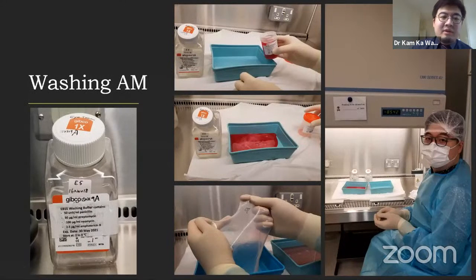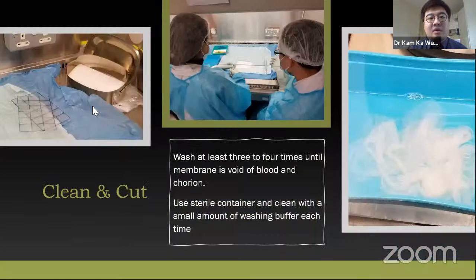We'll then transfer the amniotic membrane to our skin bank, and we'll work in a cabinet like this. We'll scrub up and wear sterile gloves. We'll pour the amniotic membrane into a sterile tray, and then wash it several times with this washing buffer, which contains penicillin, streptomycin, neomycin, and also amphotericin B as an antifungal. We'll then clean and cut the amniotic membrane according to the sizes that we designed. You can look at the grid here, and there's nitrocellulose paper here for us to mount the amniotic membrane. This is what the membrane looks like after a few washes.